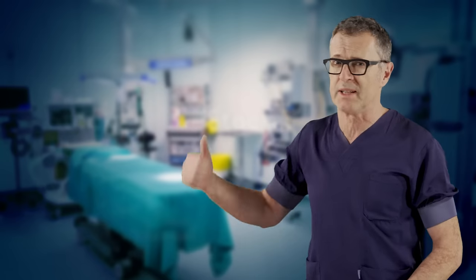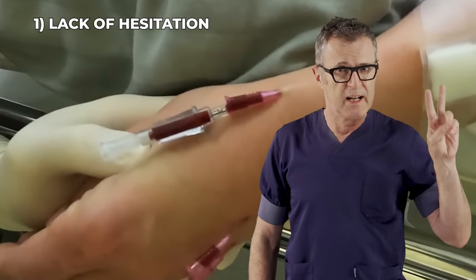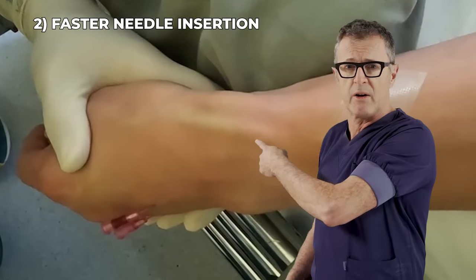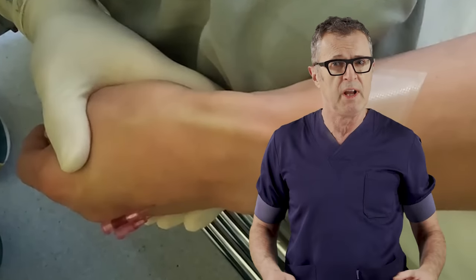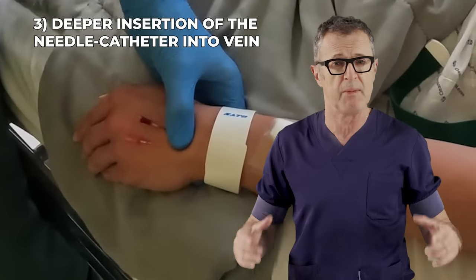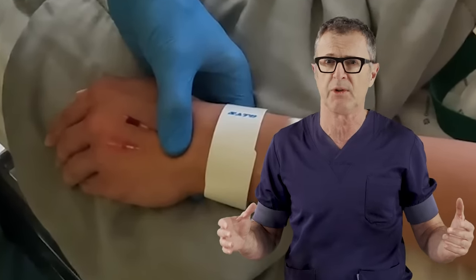All right, I hope you find this video useful. What made a difference between unsuccessful attempts and a successful placement of the IV catheter is, number one, lack of hesitation. Number two, greater speed of catheter insertion, which was required for the veins with a thicker wall. And three, sufficiently deep insertion of the catheter needle system into the lumen of the vein before attempting to feed the catheter over the needle.